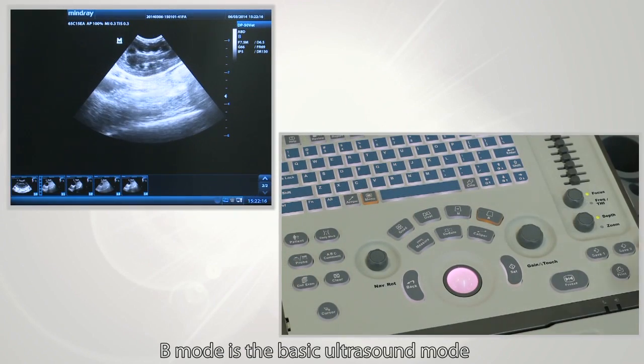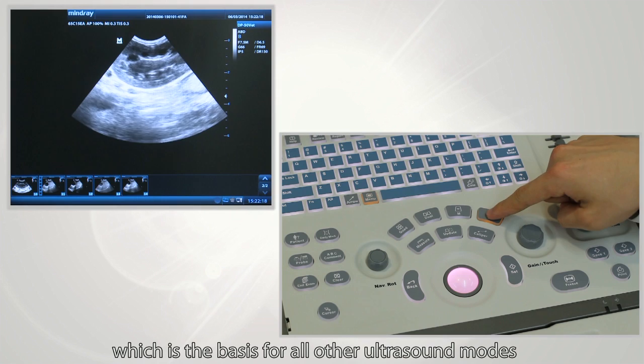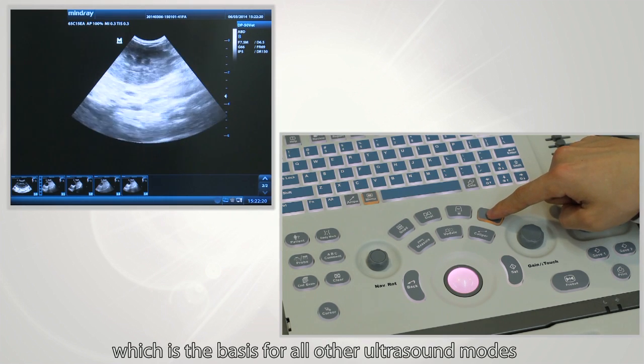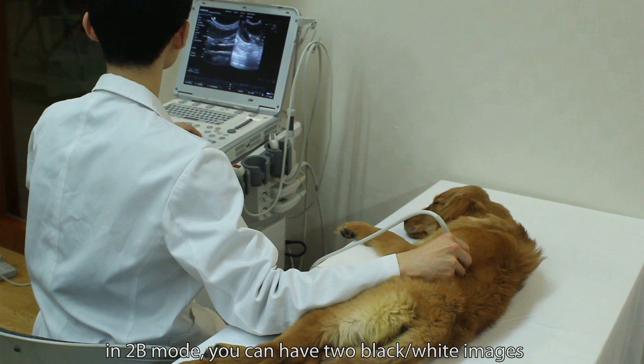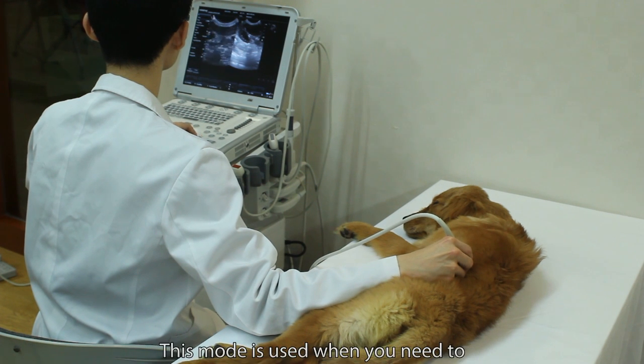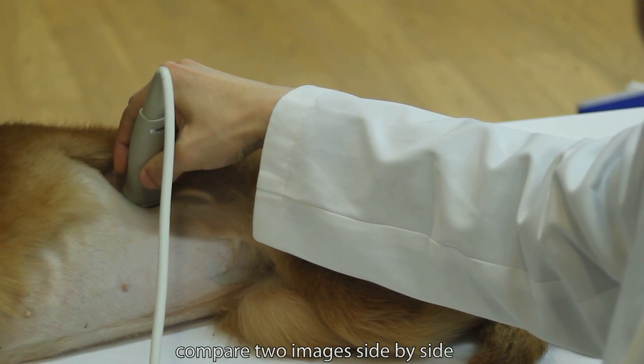B-mode is a basic ultrasound mode and is the basis for all other ultrasound modes. In 2B-mode, you can have two black and white images. This mode is used when you need to compare two images side by side.